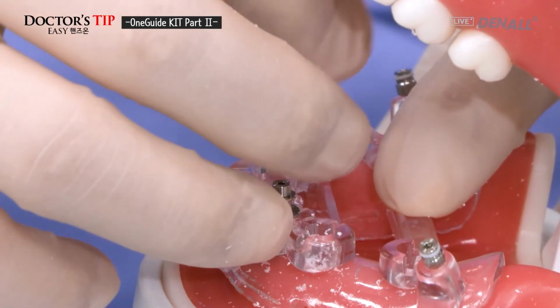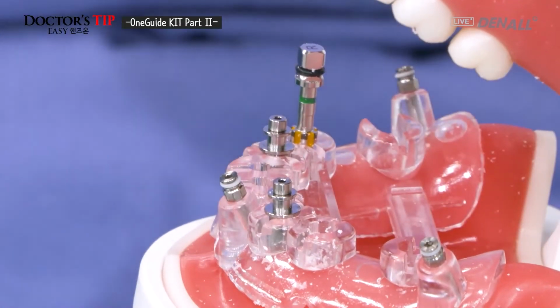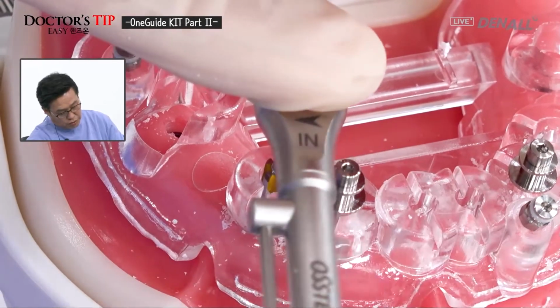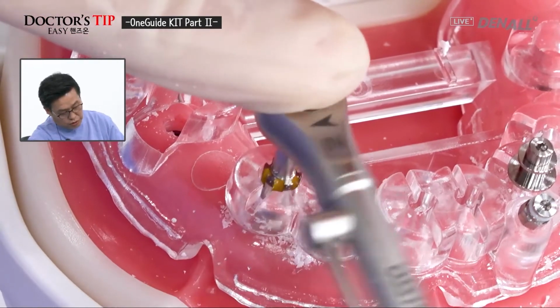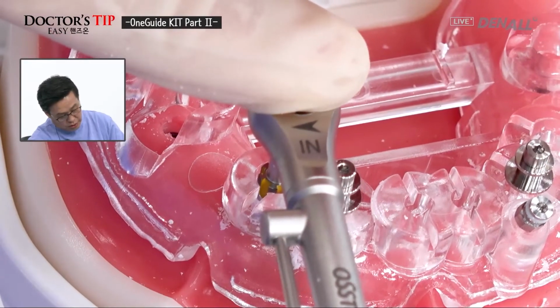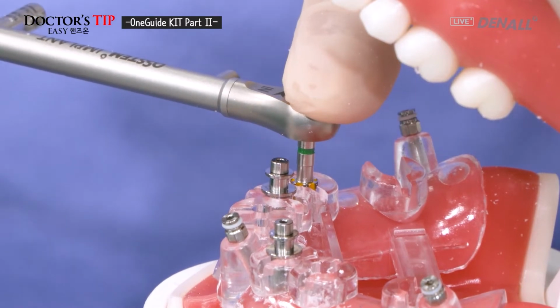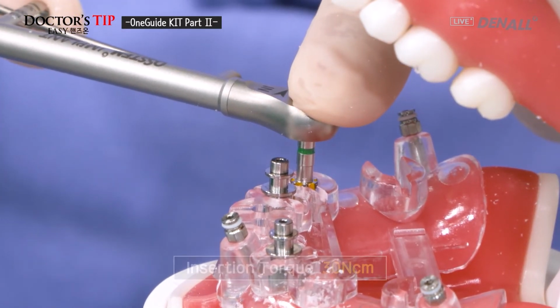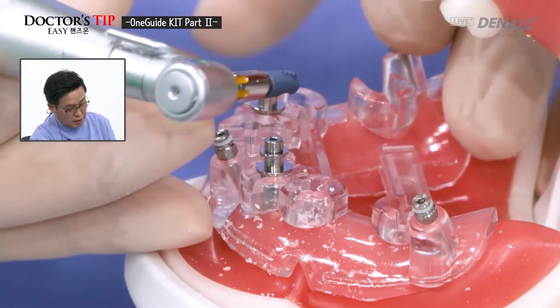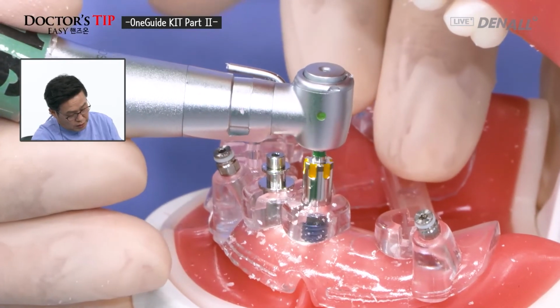And connected fully using hand wrench. Final depth control and hex control is going to be done. As you can see, align with yellow. So hex is controlled and final torque is 30 Newton centimeters. Check if it is a placement mode and the implant is going to be placed.